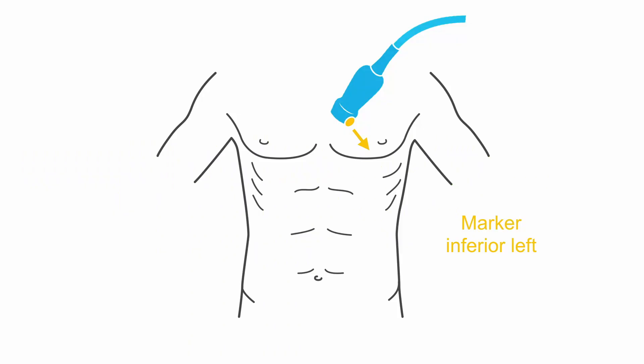Let's begin to review how to acquire the four basic ECHO views of Point of Care Ultrasound. The first view we're going to talk about is your parasternal long axis view. Using your phased array probe with your indicator to your patient's left hip, place the probe between the third and fourth intercostal space, just left lateral to the sternum.